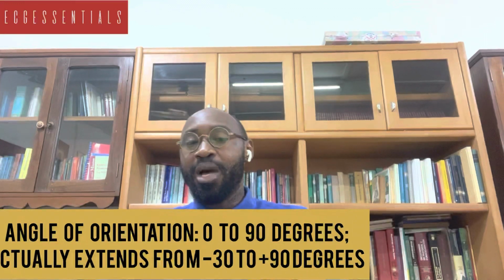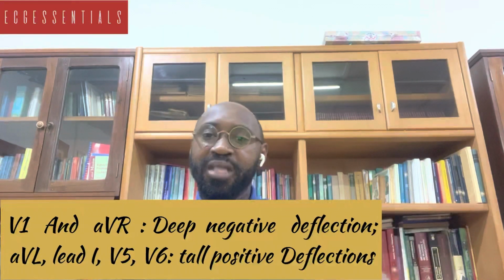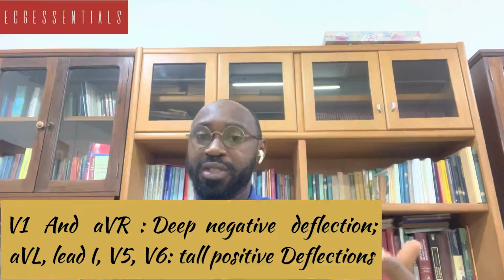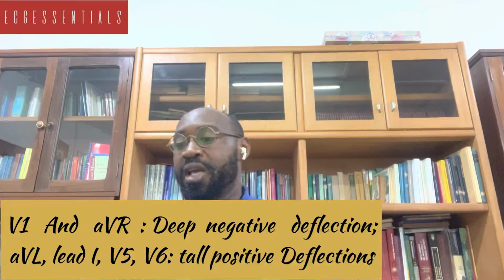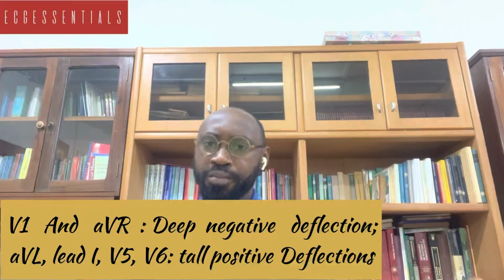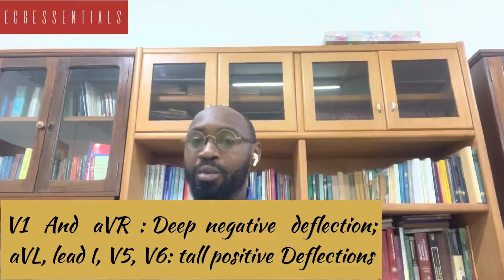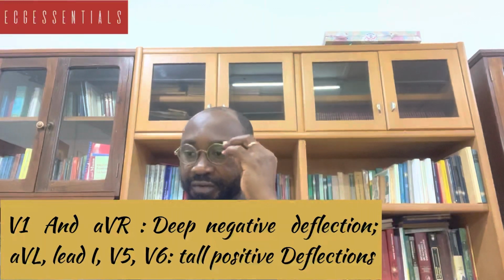So in that sense, we find that V1, for instance, which overlies the right ventricle, will usually record a deep negative deflection instead of the R, which is a positive deflection. Similarly, we are likely to find that in AVR, whereas lead 1, AVL, V5, and V6 will rather have more dominant positive deflections.